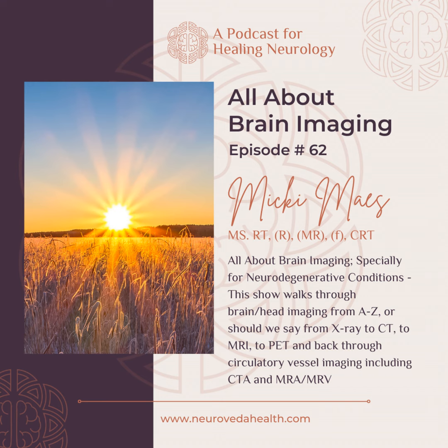So is it the asymmetry that's the problem, or is it the gestalt size of the right or the left? Does that make sense? Is it the relationship between the two halves that's the problem? That's a great question. It's both, actually. In unilateral degenerative conditions, sometimes we'll see one of the hippocampi is really small and the other one looks pretty normal. It's really common in cases of TLE or hippocampal sclerosis to have one side that's sclerotic or atrophied and the other side that's somewhat normal.